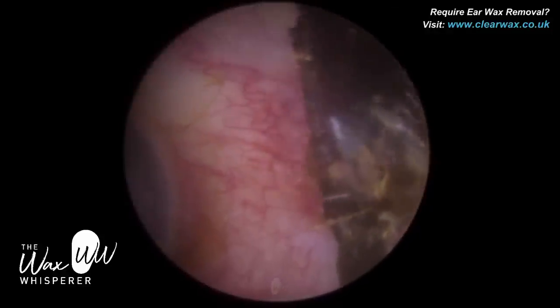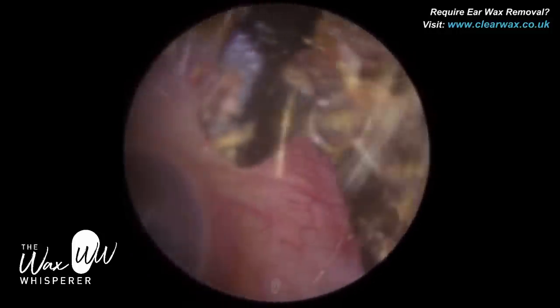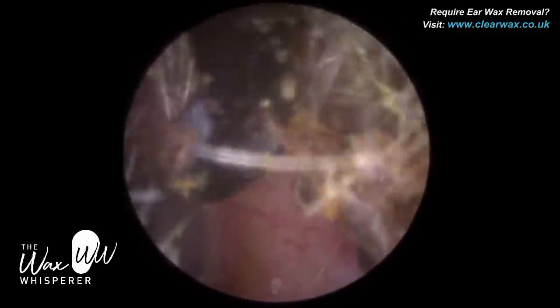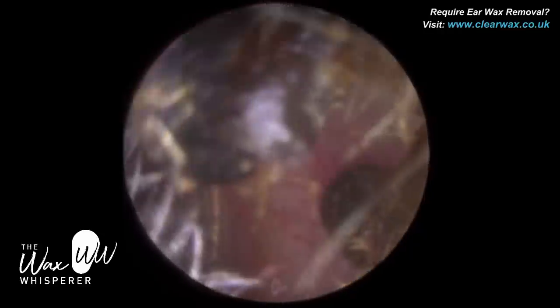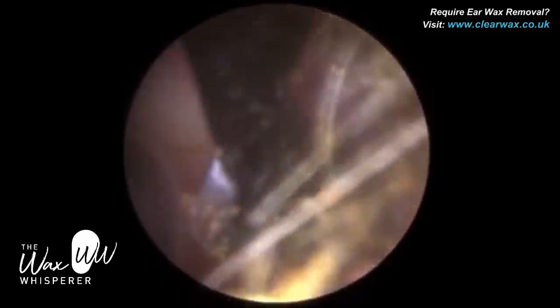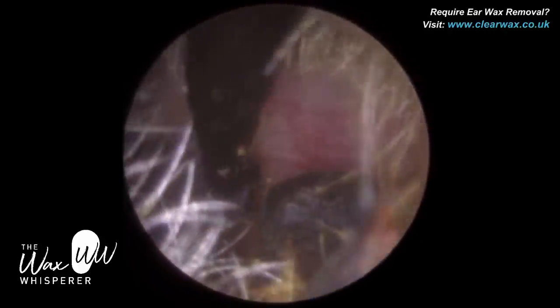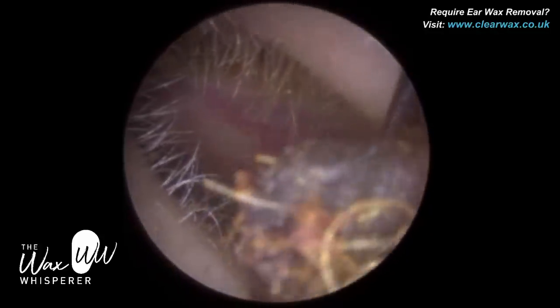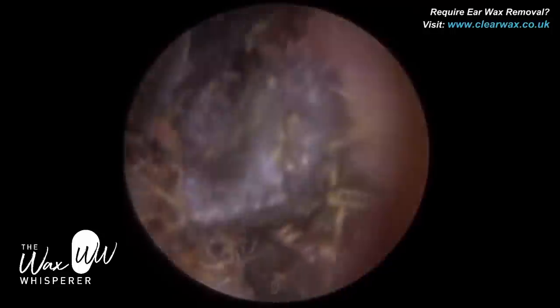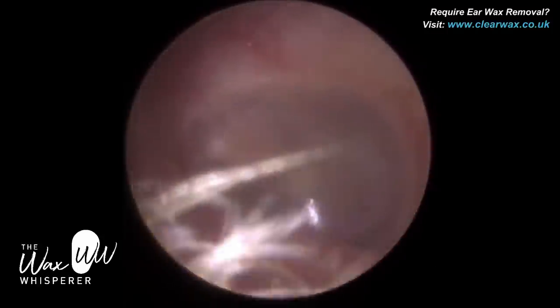In a moment you're going to see me rotate the jobson horn 180 degrees. Just where the entrance of the ear canal is on the posterior canal wall — the right-hand side, the back part of the ear canal — I'm going to gently lift it off the canal wall slightly, then revert back to the same technique to extract the fudge-type wax. The purpose of rotating the jobson horn 180 degrees is to get in behind the wax and the canal wall. At the entrance, we're far more comfortable doing that because we know we're on the cartilage portion and won't cause the patient any trauma, pain, or discomfort.